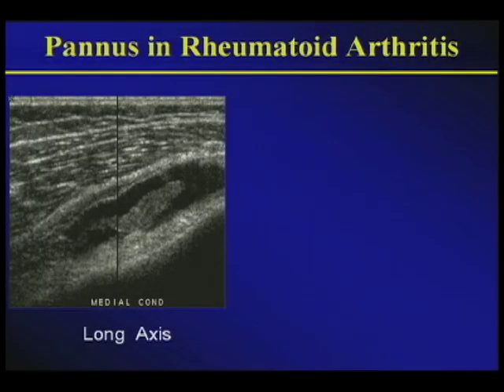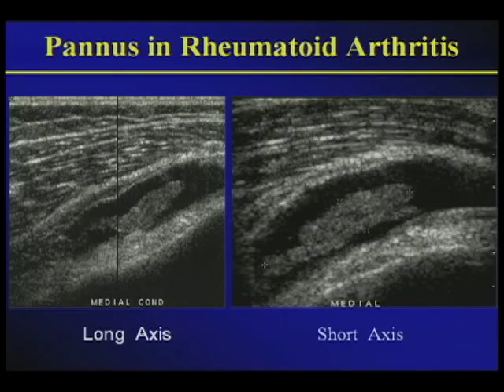Often, when you look at a swollen knee and you get a history of inflammatory arthritides, not only will this intraluminal pannus jump out at you, as you could see in this long axis view, but if you care to look around, you'll also notice what used to be imperceptible synovia now shows you a moderate thickening of the synovial lining compatible with pannus and synovitis in this individual with rheumatoid arthritis, not only in long axis but also in short axis.